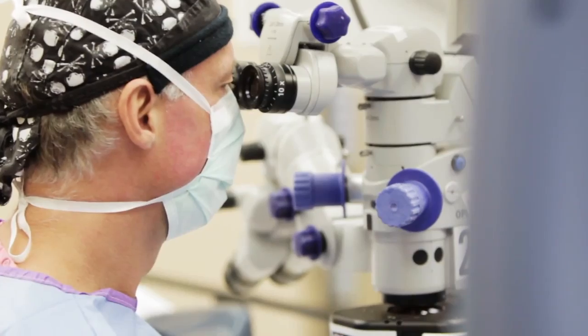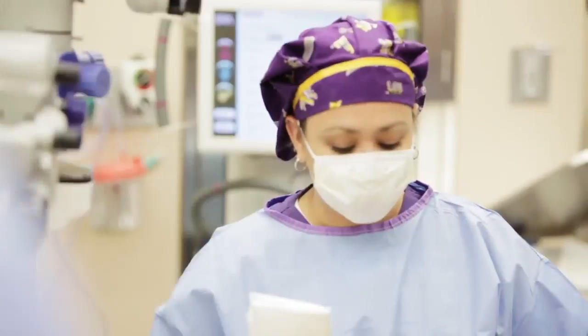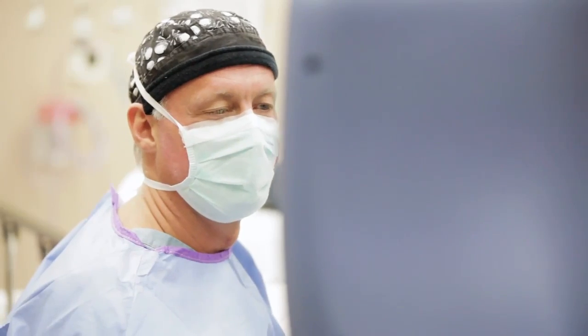The Aura system has now gone through a couple of renditions, the latest being the most effective and the best intraoperative aberrometry system I believe that's out there right now. It's been very effective today — we've confirmed some of our preoperative calculations and kept the lens powers the same.